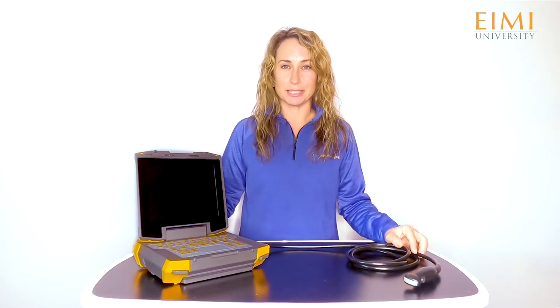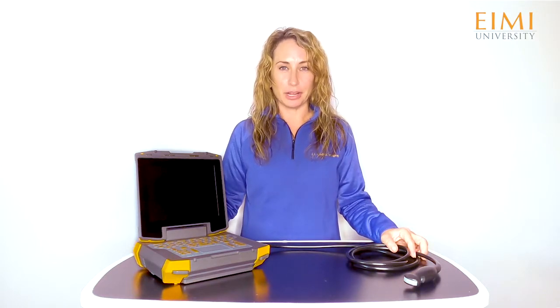The Evo 2 is the latest in the Ibex family of ultrasounds. It's our most powerful and capable system to date, while still maintaining the portability and ruggedness that our products are known for. The expanded list of functions makes the Evo a great fit for companion animal and equine practices, but its greatest strength is its overall versatility for any application.